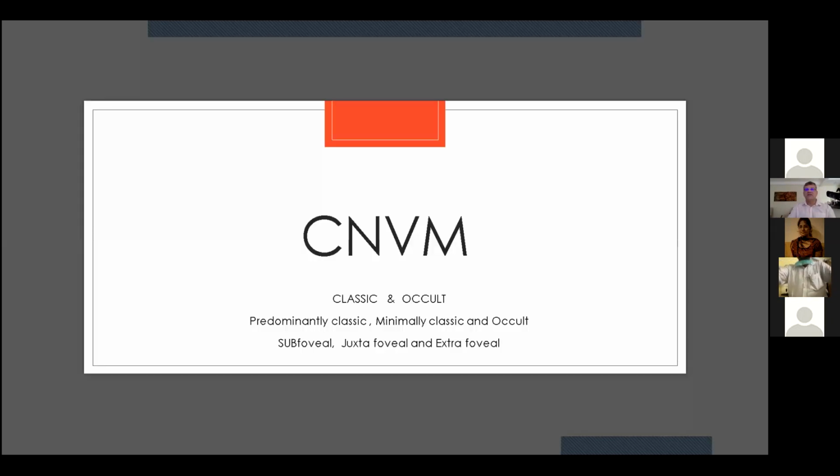Coming to CNVM. In CNVM, fluorescein angiography plays an important role. It helps us to diagnose whether it is a classic type or an occult type. If classic, is it predominantly classic or minimally classic, and where is the location? Is it subfoveal, juxtafoveal, or extrafoveal?